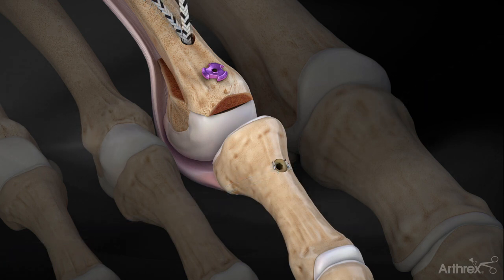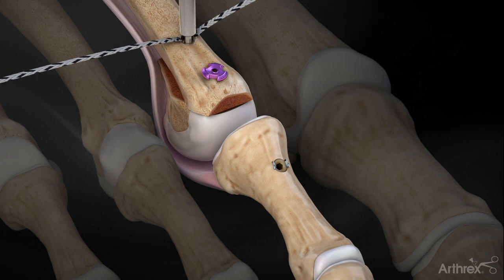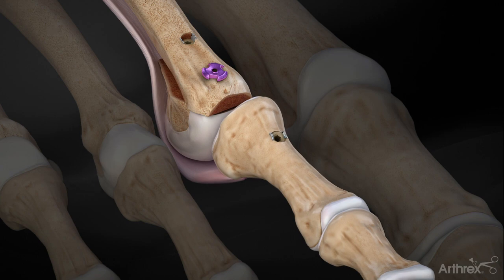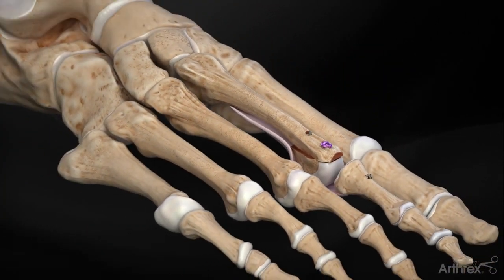Finally, pull the labral tape sutures exiting the metatarsal to set the final tension of the construct. Ensure the appropriate amount of dorsiflexion can be achieved, and insert the final 3 by 8 mm tenodesis screw into the metatarsal tunnel between the two sides of the labral tape. This completes the repair.